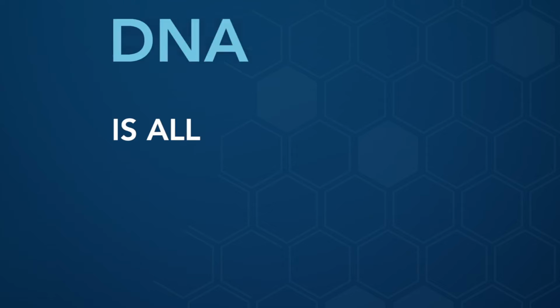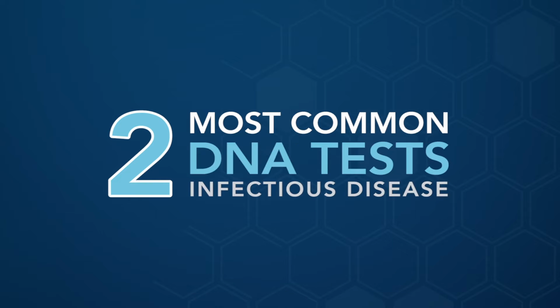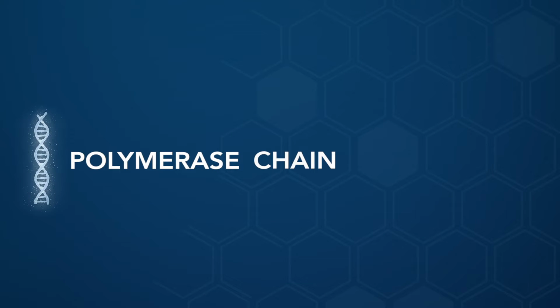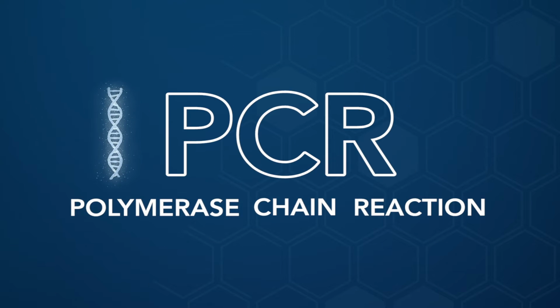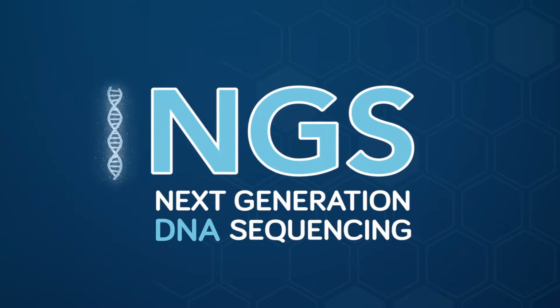More and more physicians are moving away from microbiology labs with standard culture testing and are moving toward molecular diagnostics using DNA testing. But is all DNA testing the same? The two most commonly used tests for infectious disease are polymerase chain reaction, also known as PCR, and a more advanced DNA test, next-generation DNA sequencing, known as NGS.